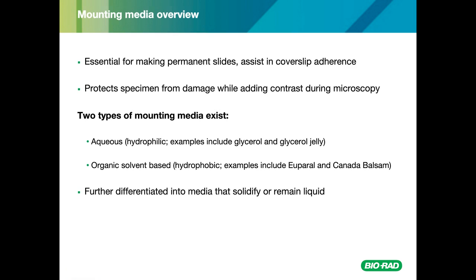Two types of mounting media exist: aqueous or hydrophilic mounting media. Examples of aqueous mounting media are glycerol and glycerol jelly. Organic solvent-based or hydrophobic mounting media. Examples of those are Euparal and Canada balsam. Mounting media can be further differentiated into media that solidify or remain liquid.